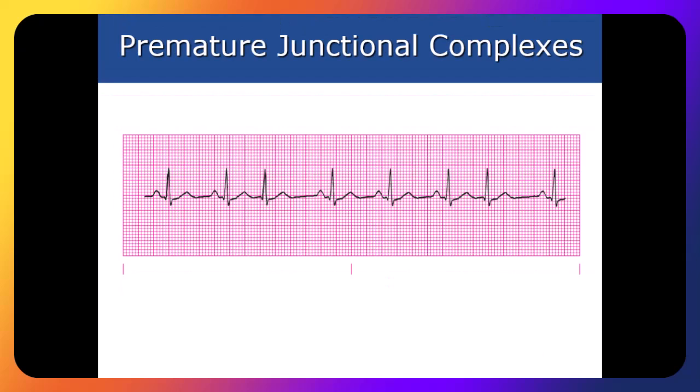Do you have a compensatory pause? Yeah. Now, when might that compensatory pause be a problem? I may have asked you this before, so if I did, we'll see if you were listening. When might that compensatory pause be a problem?